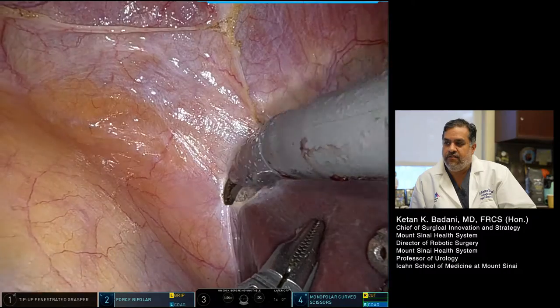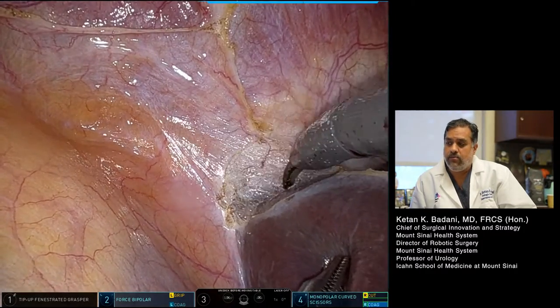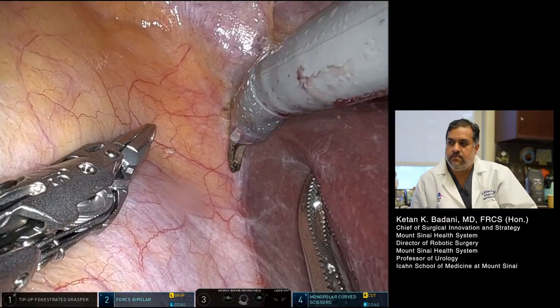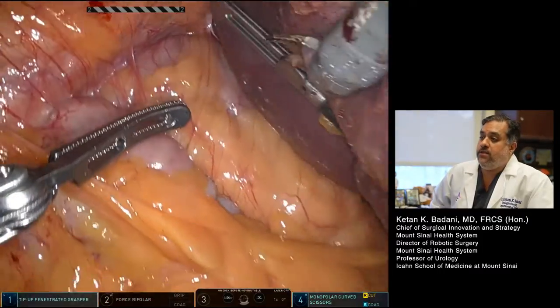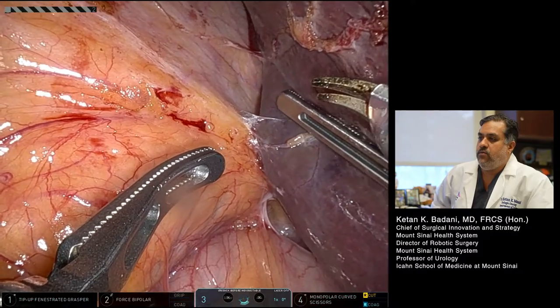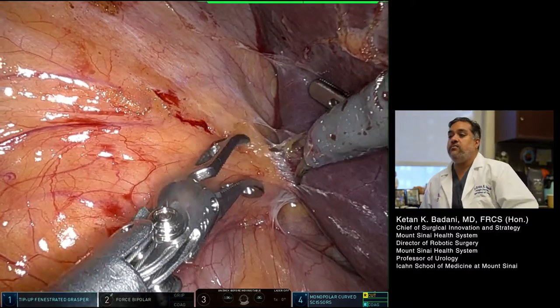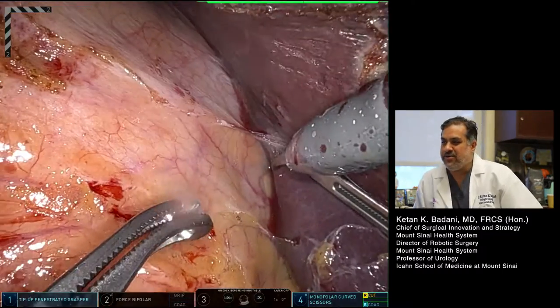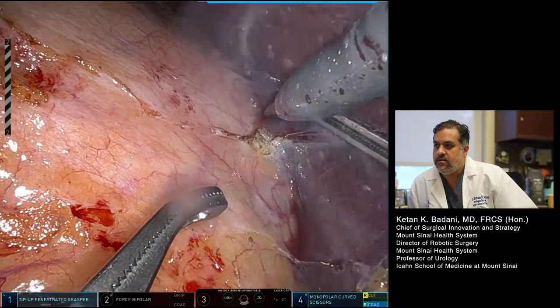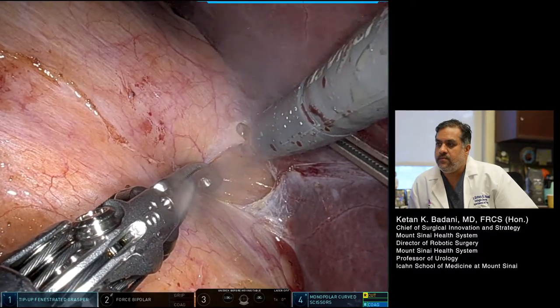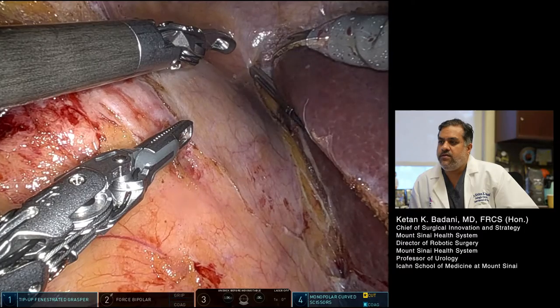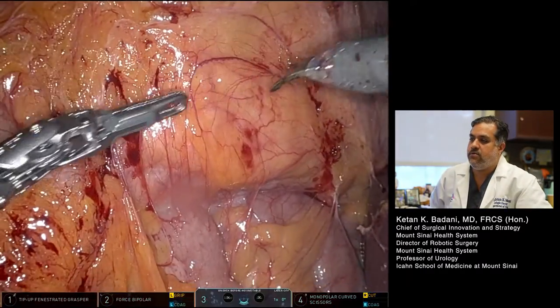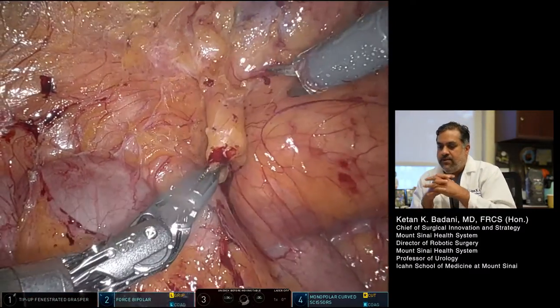On the diaphragm I release the liver a little bit so I have somewhere solid to grab with the locking retractor — that's my very last step. Now we're coming in with the liver retractor through the sub-xiphoid port and we're able to carefully, safely, and very effectively reflect the liver. There's a little bit of adhesion left here; we'll cut that, then move on with the actual kidney part of the operation. This little pocket between the Gerota's fascia and the liver is always nice to create so you have something strong to grab with the locking retractor.